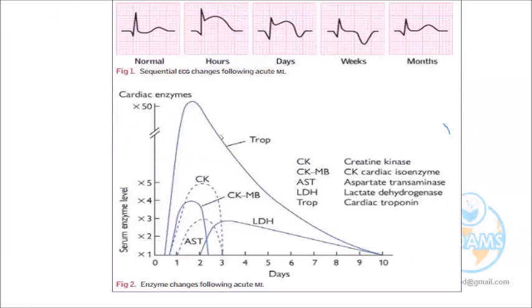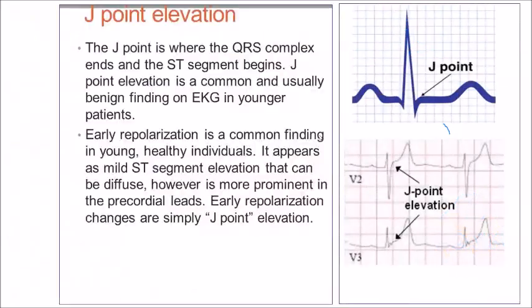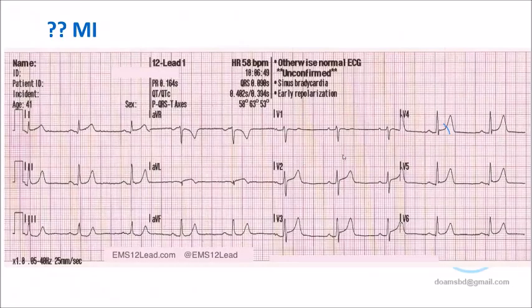But here, sorry, doctor, for the little inconvenience, I'm just jumping. In this ECG, this point is clearly visible. Everywhere the point is clearly visible. But it will actually make us alert that it might be myocardial infarction. Somewhere we have this nightmare: oh my God, this is ST elevation. Actually, it is not.